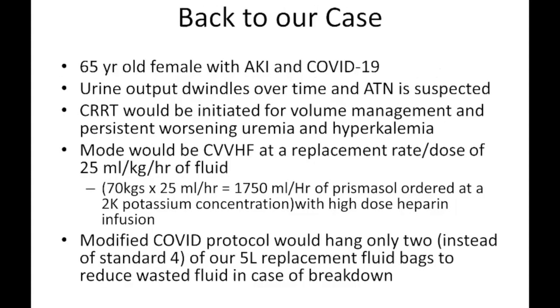Okay, so running through, and I apologize for the couple of typos in this talk. Running back to our case, we have a 65-year-old with AKI. Though there's some urine output, she remains hypoxic. She's received volume resuscitation. However, the patient's intubated on a high oxygen flow, receiving many drips, and is unable to remove enough fluid on her own to make up for all the fluid coming in from the drips.